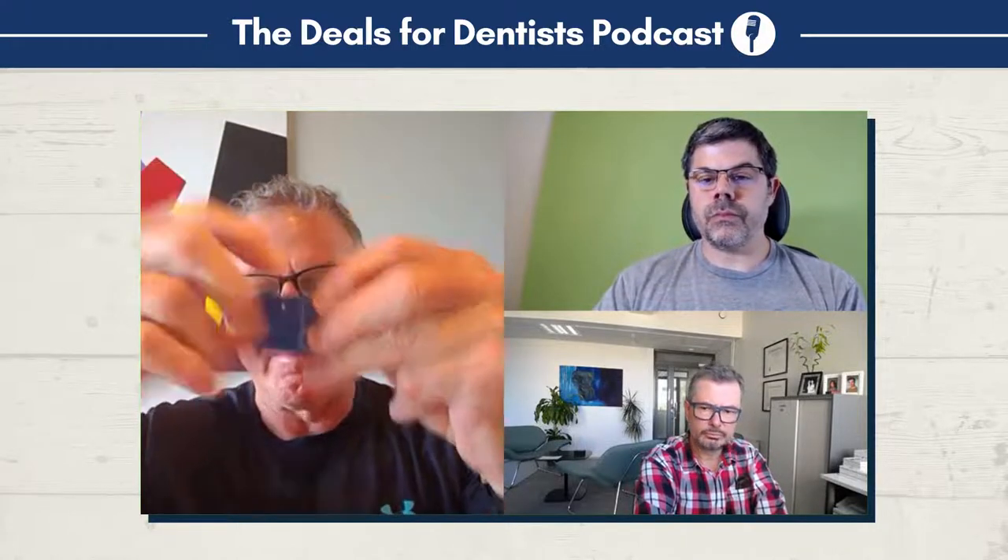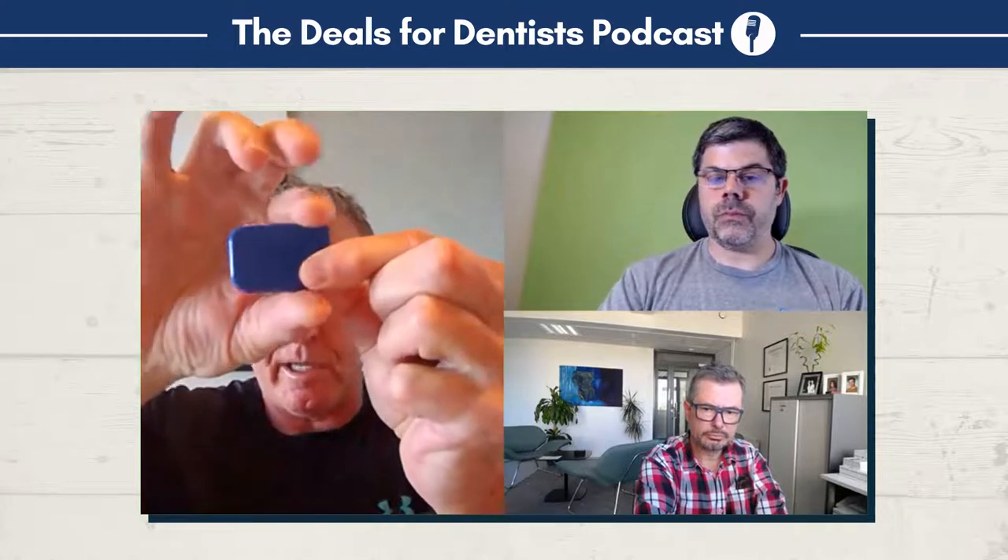We've designed these zero profile holders that clip on to the back side where the battery is, so there's nothing surrounding the edges to create dig into the tissue, the floor of the mouth, the roof of the mouth. You get all that complaint from the patient eliminated.